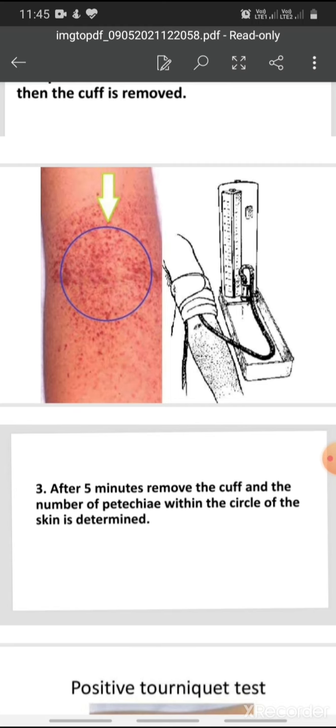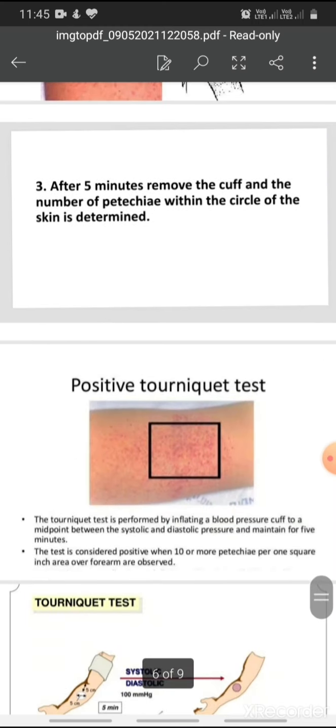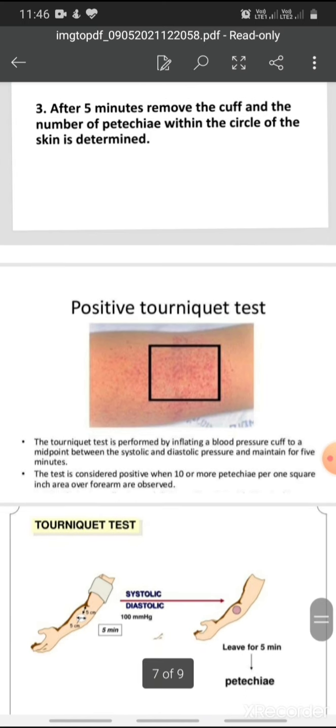For a positive tourniquet test, you can see the area we have selected. If there are more than 20 petechiae, that means our tourniquet test or HESS test is positive.